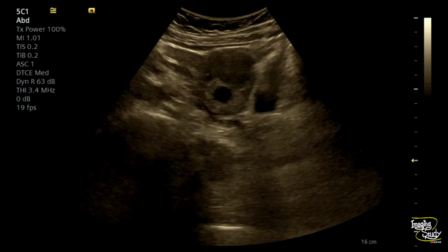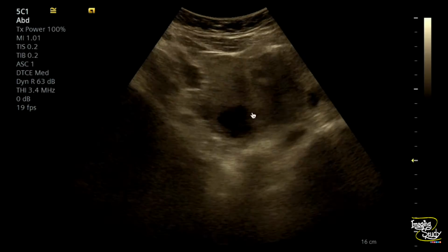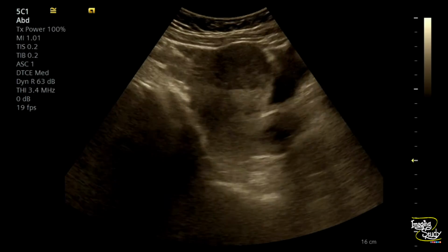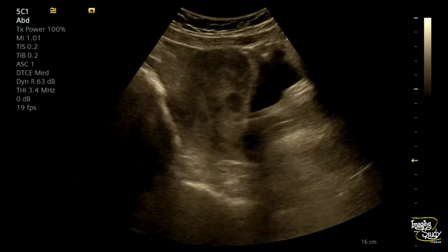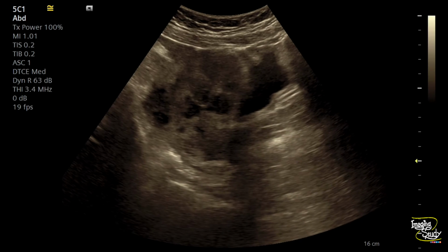Here's the transabdominal ultrasound picture. The bladder was partially filled and you can see the uterus is quite heterogeneous. There are multiple hypoechoic areas, quite like fibroids, seen throughout the parenchyma. So that's a very confusing state here. Here are some pictures of the transabdominal ultrasound with a partially filled bladder, so don't expect much better quality. I was checking the patient transabdominally before starting the TVS. So these are the hypoechoic areas.